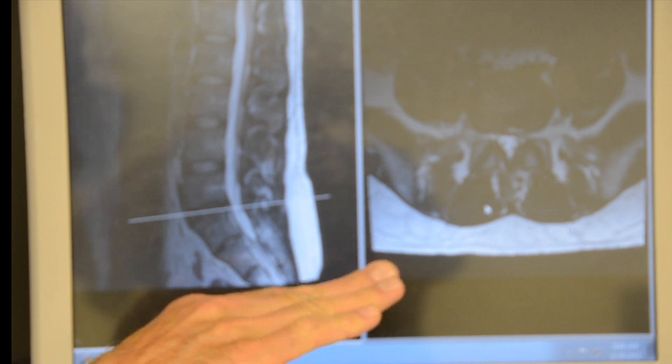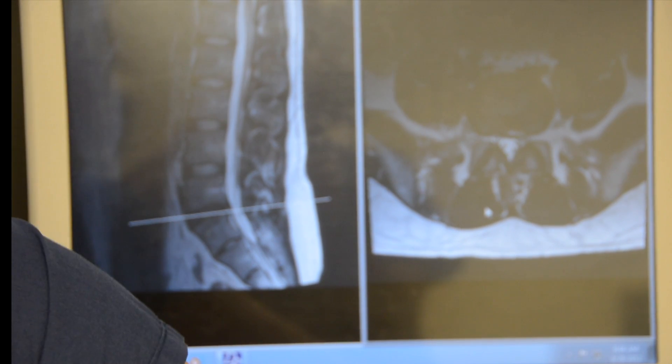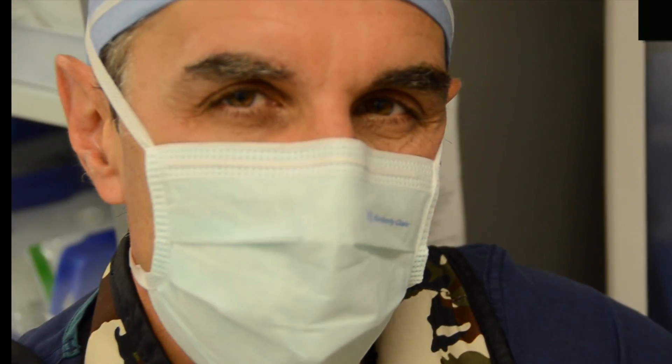You'll see that going in — we'll put it into the disc space, restore the disc height, and get him normal motion in the spine, and hopefully take care of his low back pain and get him back to normal function quickly, usually in around four weeks. I'm Dr. Larson, let's get started.